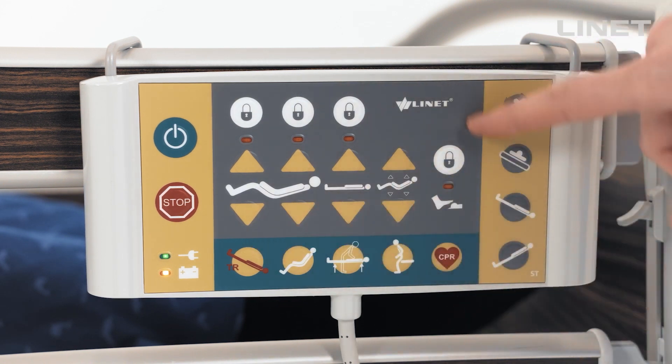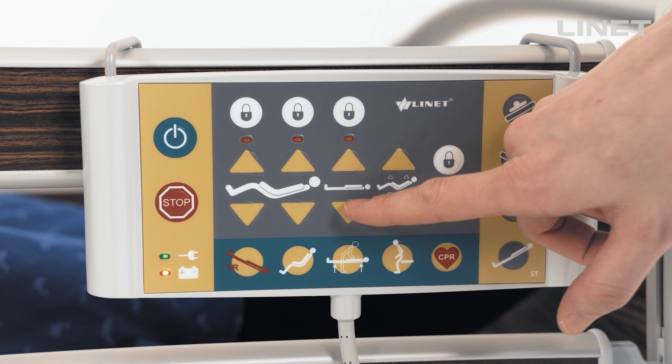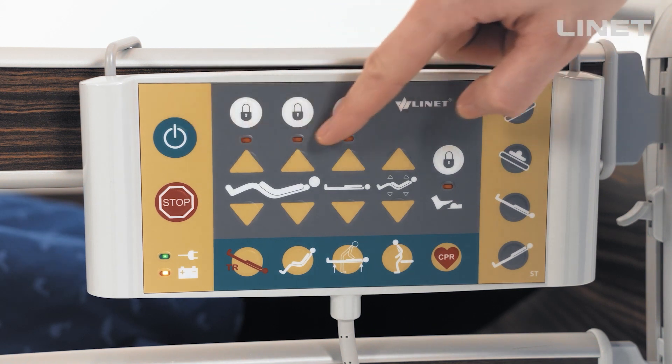There are basic functions in the gray section: thigh rest up or down, backrest up or down, height adjustment, and an auto contour button. The lockout function can lock individual controls.